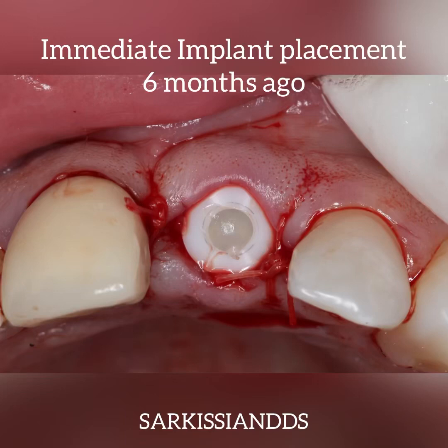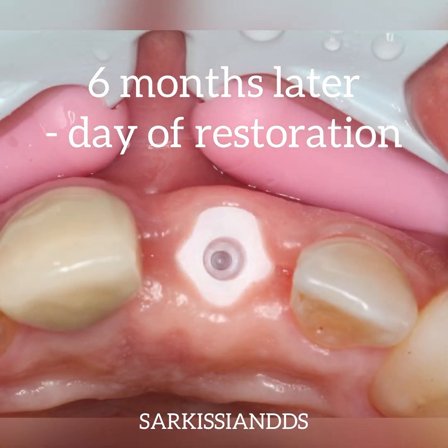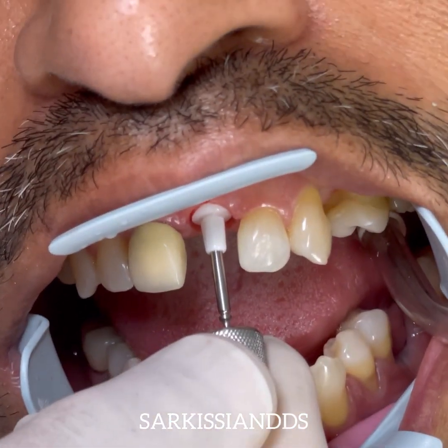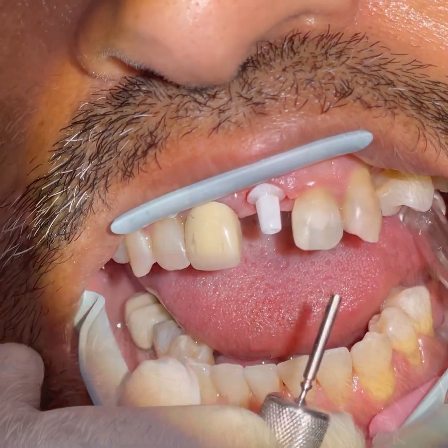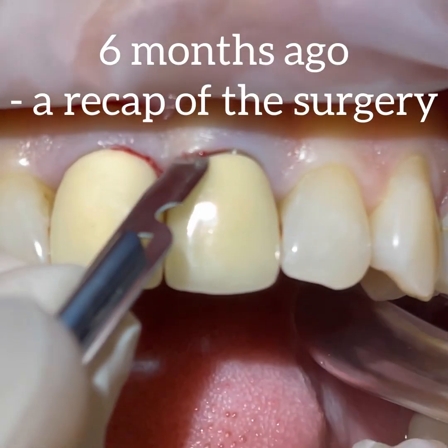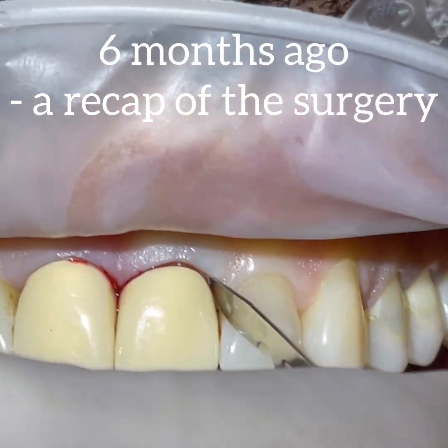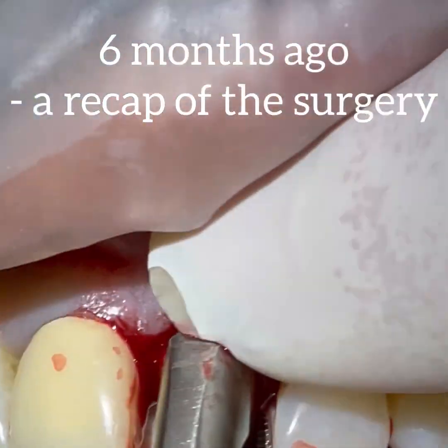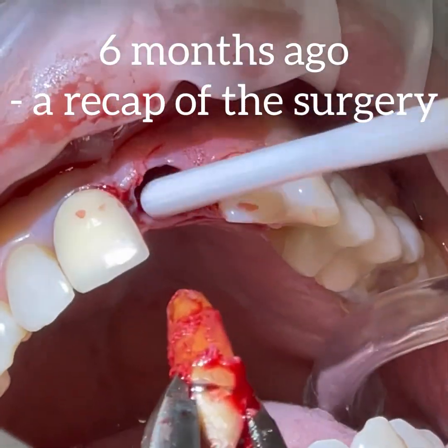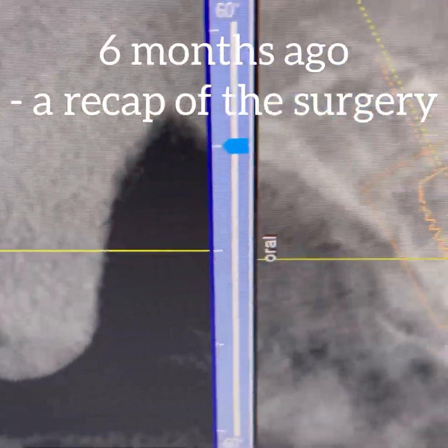I'm happy to present this immediate implant case from beginning to end. I've been anxiously waiting to restore it and to show all the steps for placing the abutment and fabricating the same-day CEREC crown, sending this gentleman back without a gap in his front teeth. Six months ago we extracted his front tooth and planned to place an immediate Z Systems zirconia ceramic implant. This is a recap — the full case was posted about six months ago, and most of the instrumentation and drilling is not shown here.